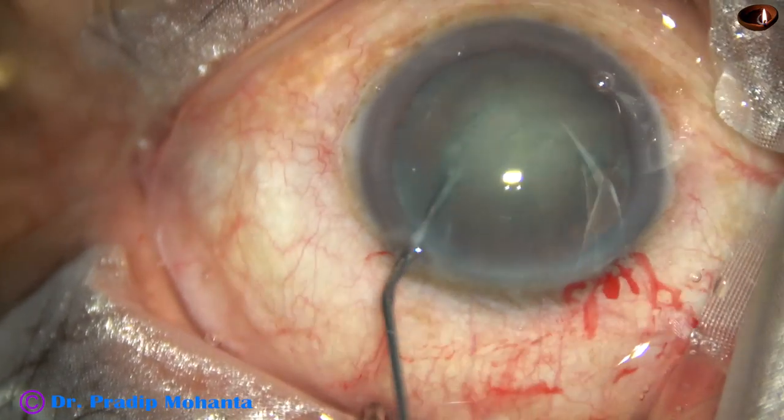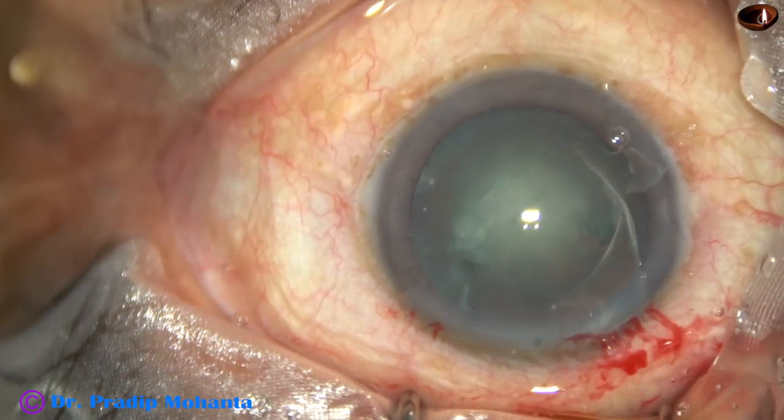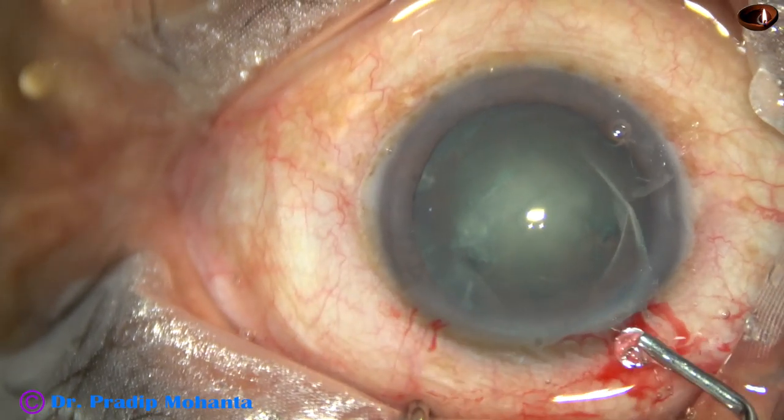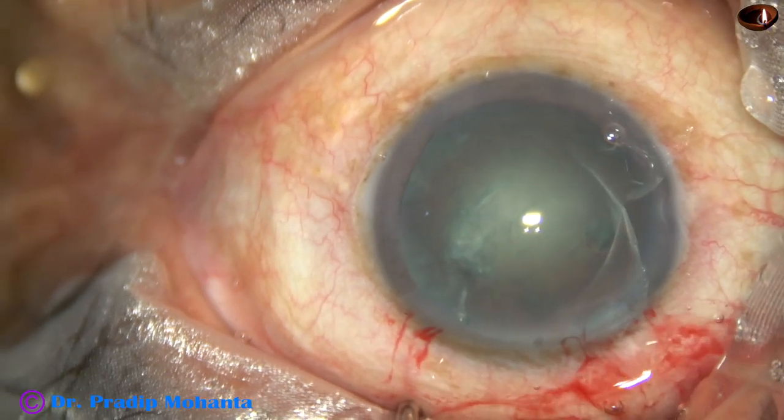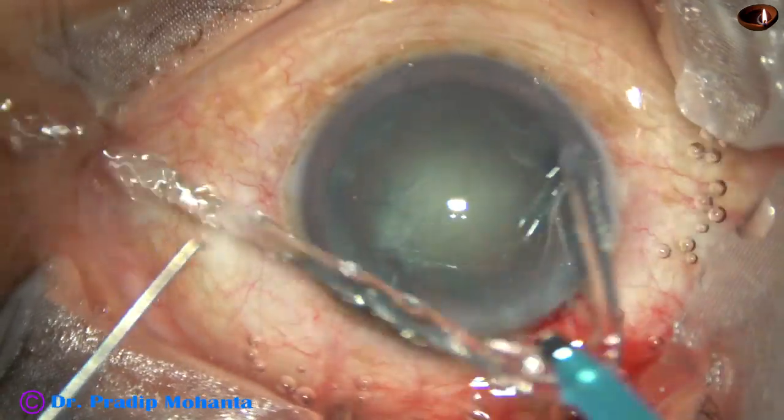The nucleus is tapped and the nucleus is rotated. Visco is again injected. And now, see the direct chop.